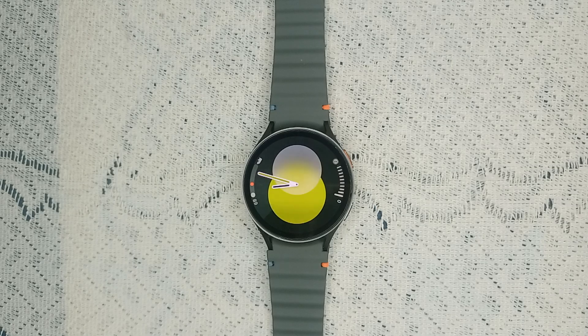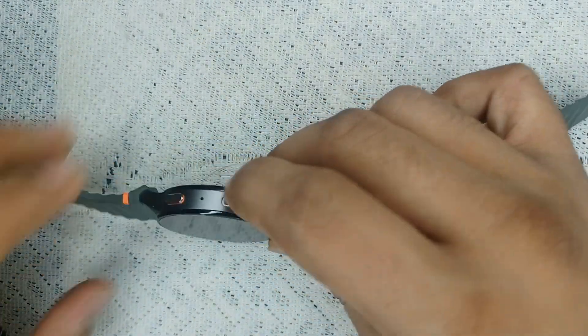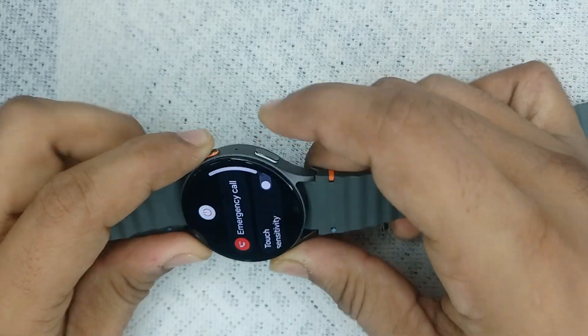Step three is to close and reopen the Samsung Health Monitor app. Sometimes the issue may come from a network issue or software glitch, so simply close the app completely on both your watch and your smartphone, then reopen it. If closing and reopening does not fix the issue, restart your watch by pressing and holding the power button and the bottom key together until you see the Samsung logo on your screen.